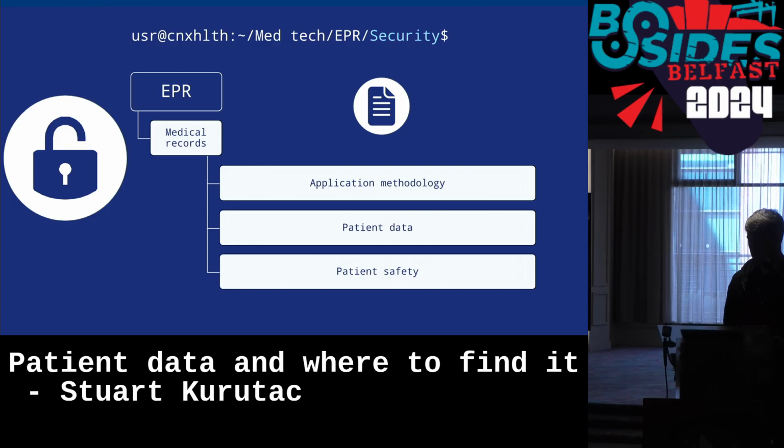Well, essentially you just apply your application methodologies to them. Always be thinking about how you're extracting patient data and how you'd impact patient safety. Never be thinking about, I want to get the admin or whatever. I mean, still a good goal to have, but you might not need admin to do this. You could have a low level user and just absolutely rinse all the data out of it. And that's way worse than striving to get admin with the same results, basically.